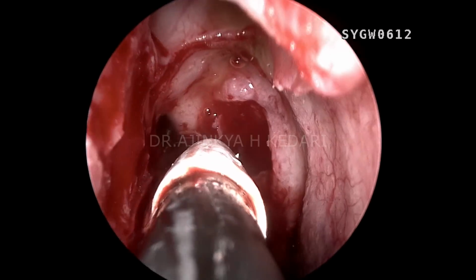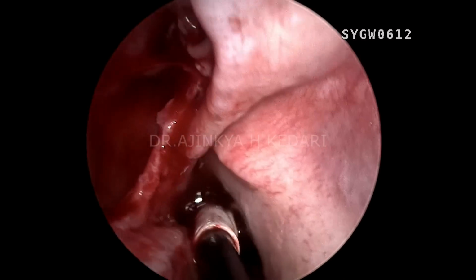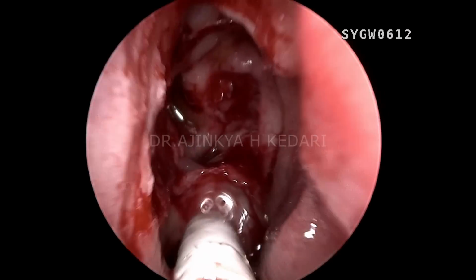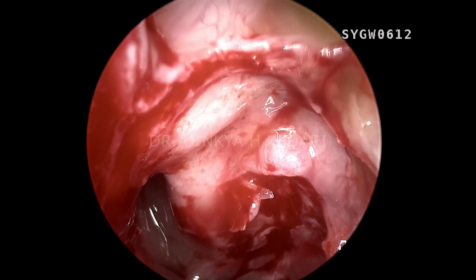So I'm going to wash, and then I'm going to do a suctioning just to remove any clots and to keep the surgical field clean. That's the choana behind. That's the huge choana. You can see some mucoid secretions up there in the choana. So you can see we have a very huge opening and a good access for our CSF leak site.